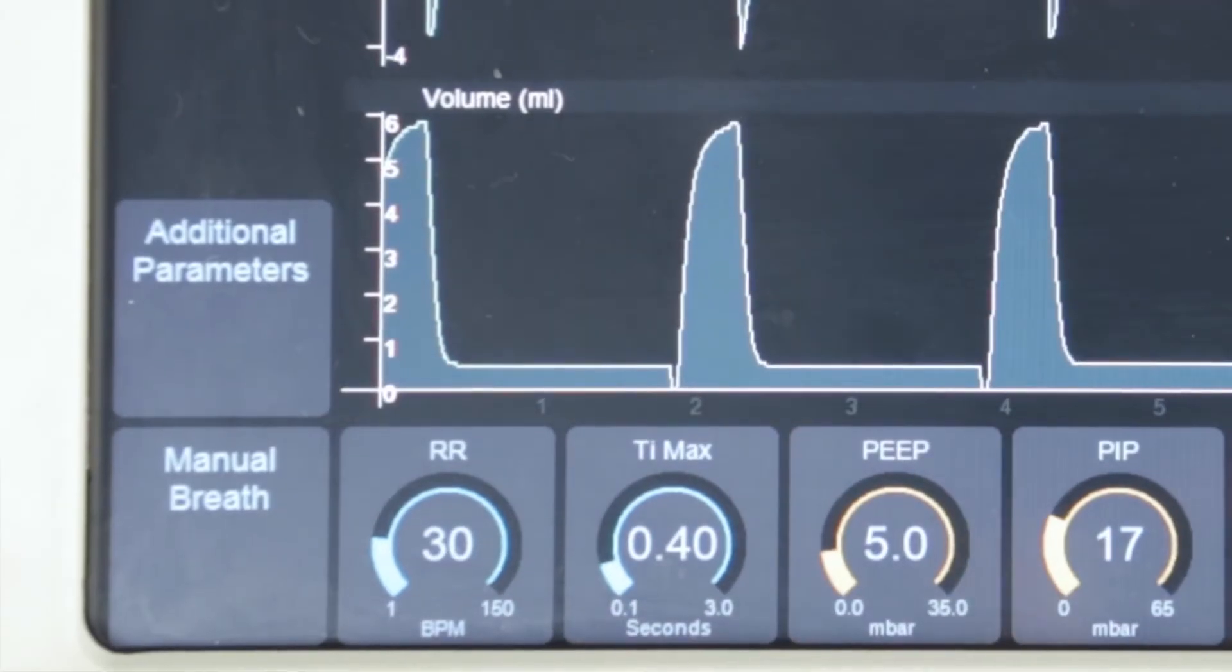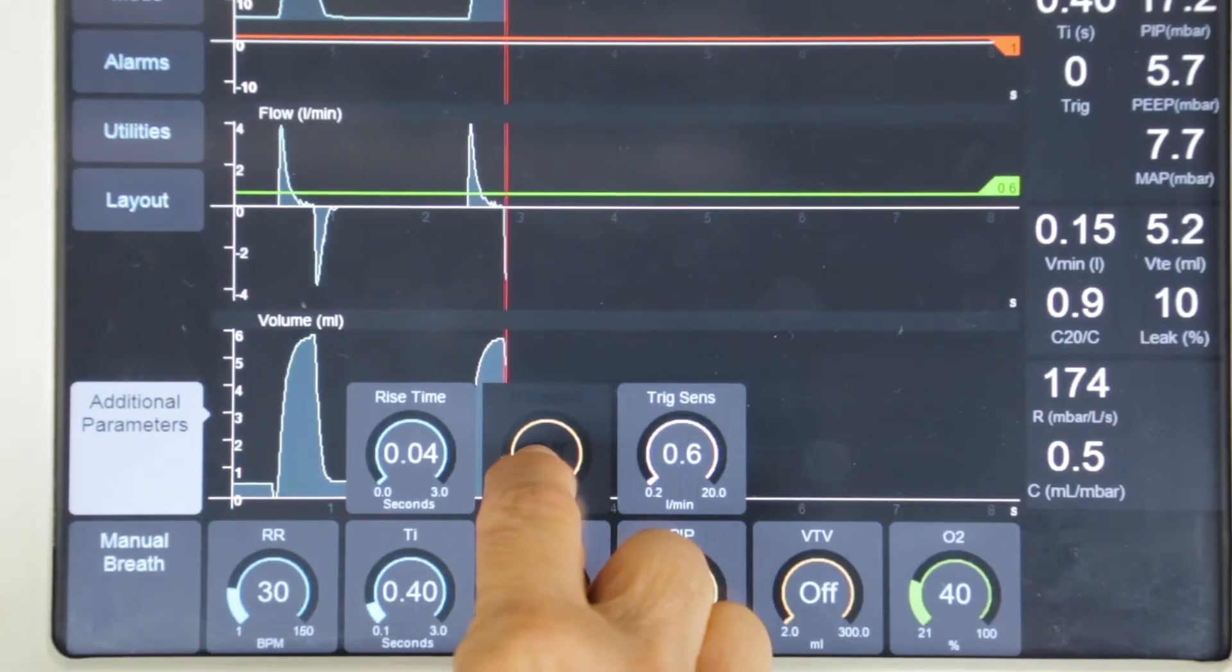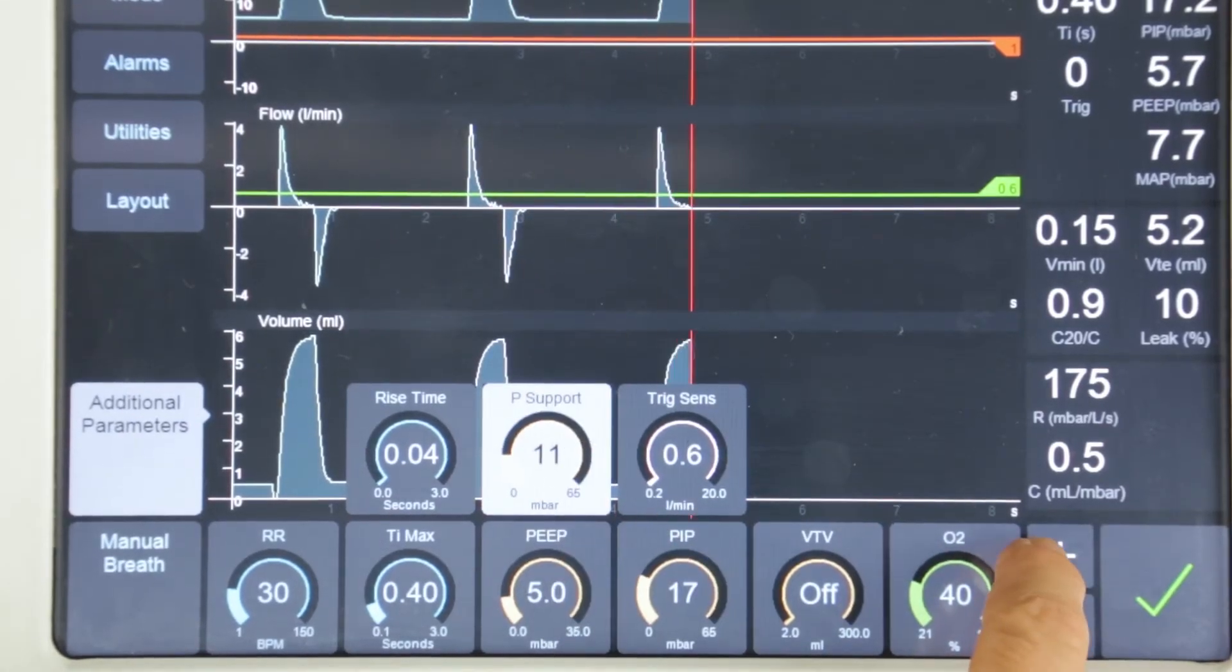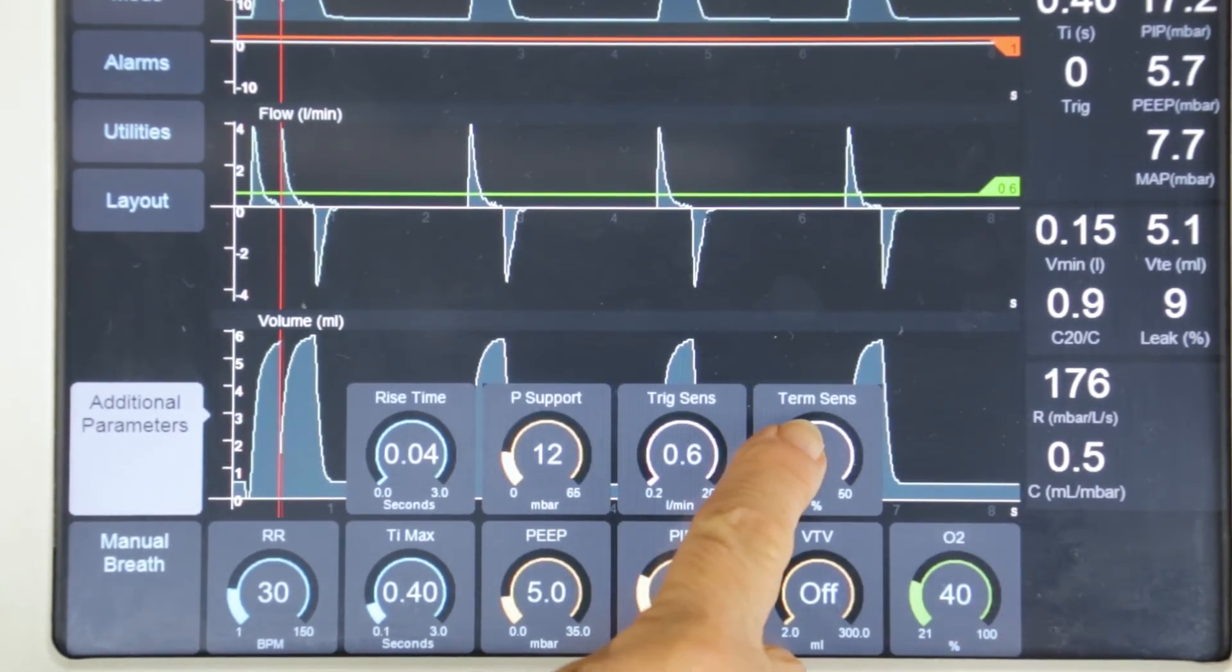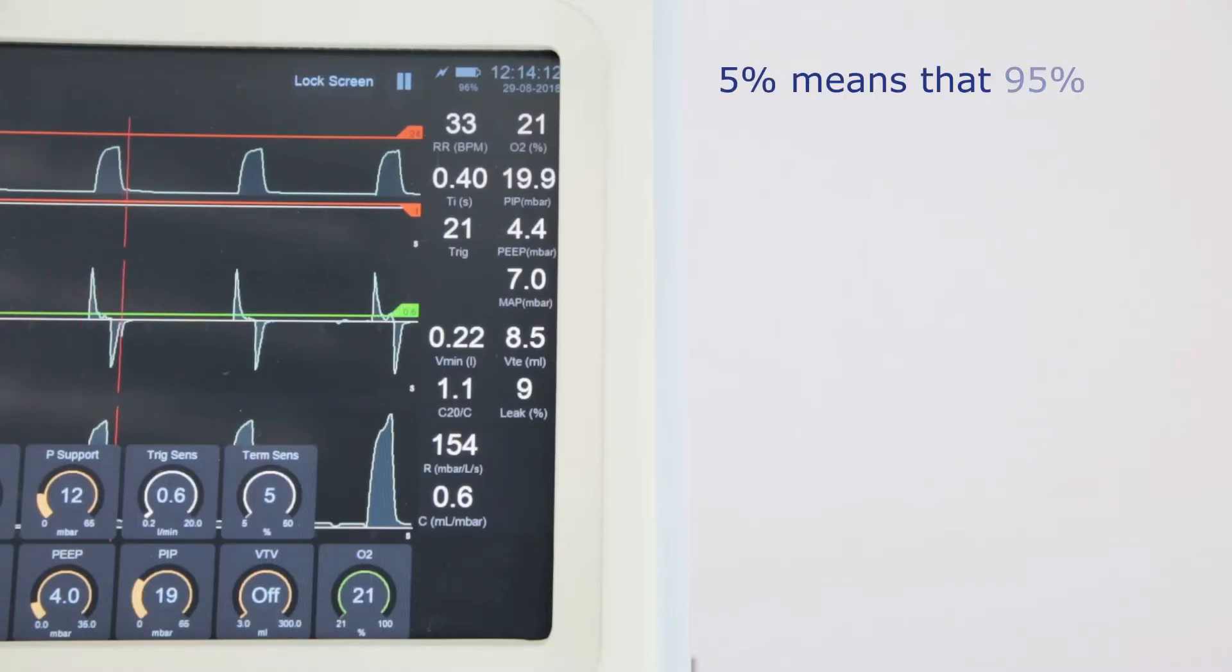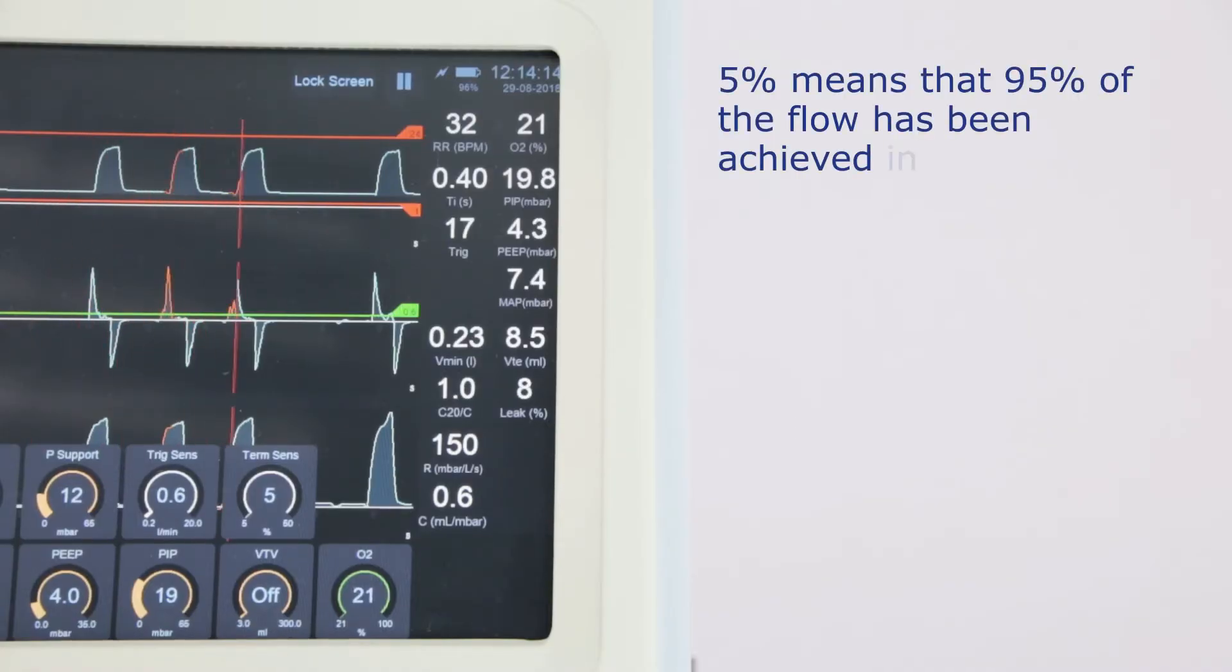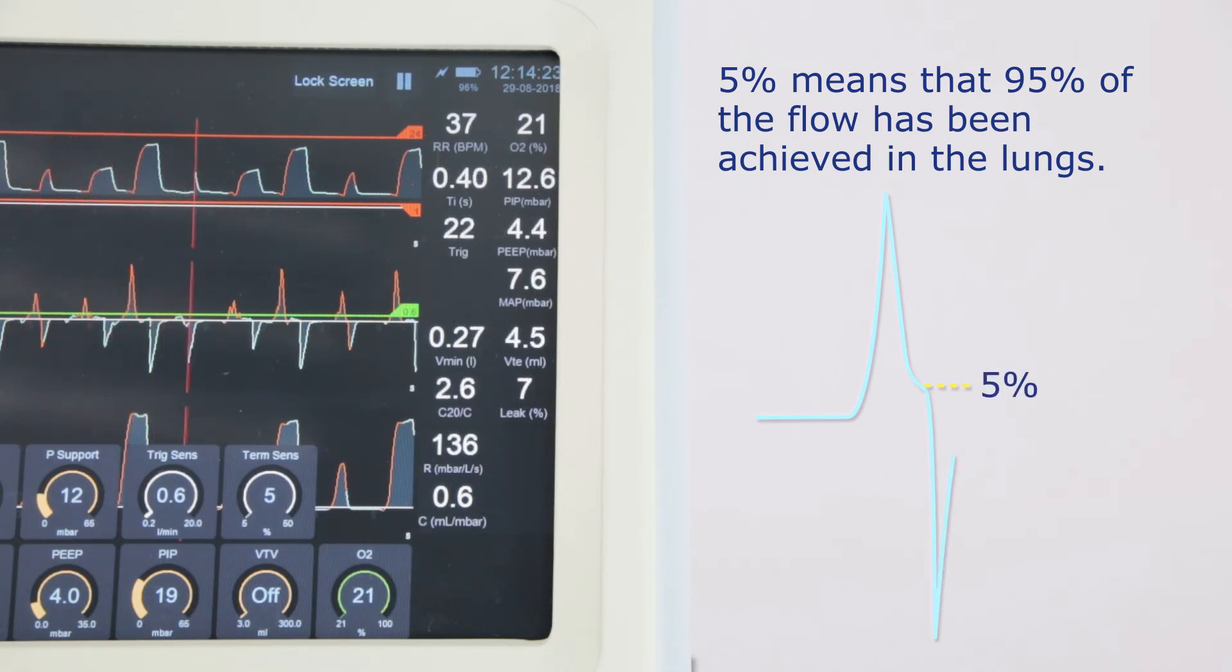To activate PSV in SIMV mode, press on additional parameters and press and hold pressure support. Next to this button is a button called termination sensitivity. The default setting is 5%, meaning that 95% of the flow has been achieved in the lungs. The flow is rapidly delivered, peaks and then decelerates to the termination sensitivity level, and at this point inspiration stops and expiration commences.